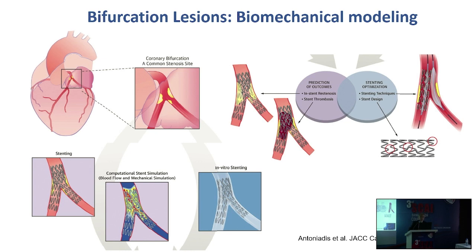So when you put a stent in this main branch, this plaque that is in here will not close the branch. What will close the branch is a shifting of the carina. So you are compressing this carina in this direction, and this is what most times will happen. So it is not the plaque that is inside that will block the artery. That is important for you to plan your procedure.